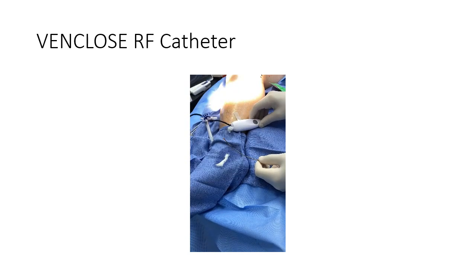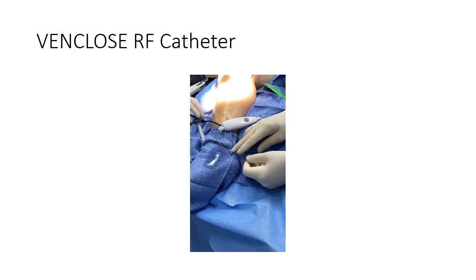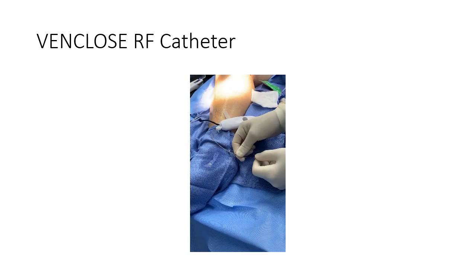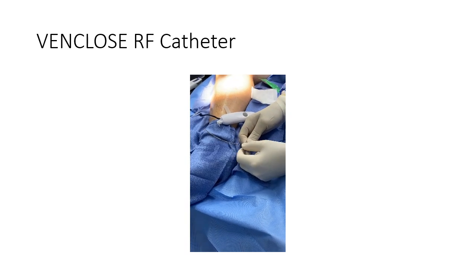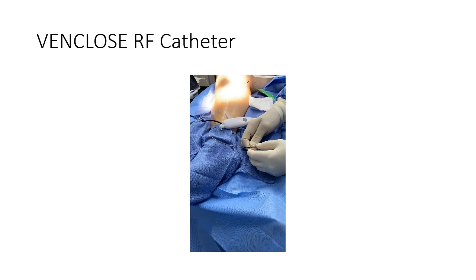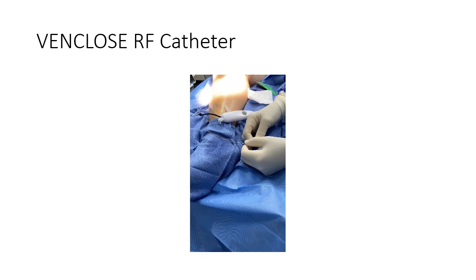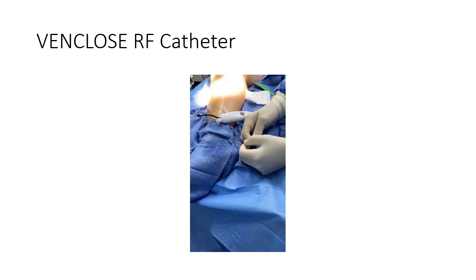Now I'm going to put the catheter in and show you on ultrasound how we prevent HEX from forming, because we're going to be compressing the junction. We'll show you after we get the catheter in and tumescent how we prevent the HEX. In the last 100 cases, there has not been one heat-induced thrombus, and we think that is probably from how we compress the junction.